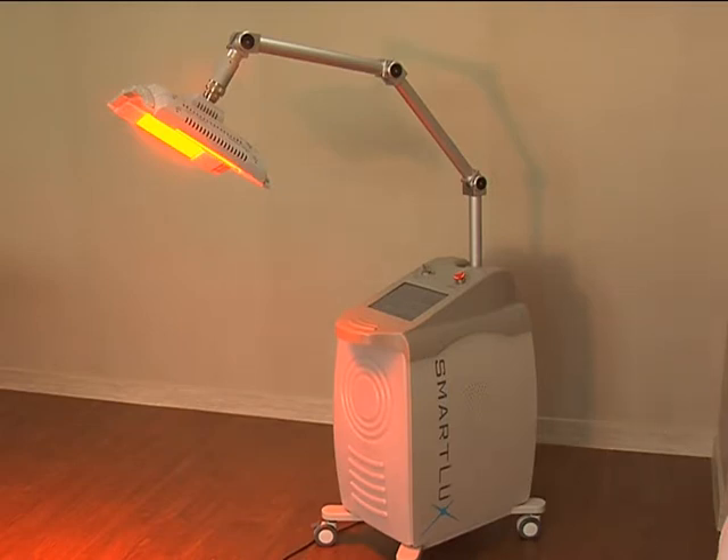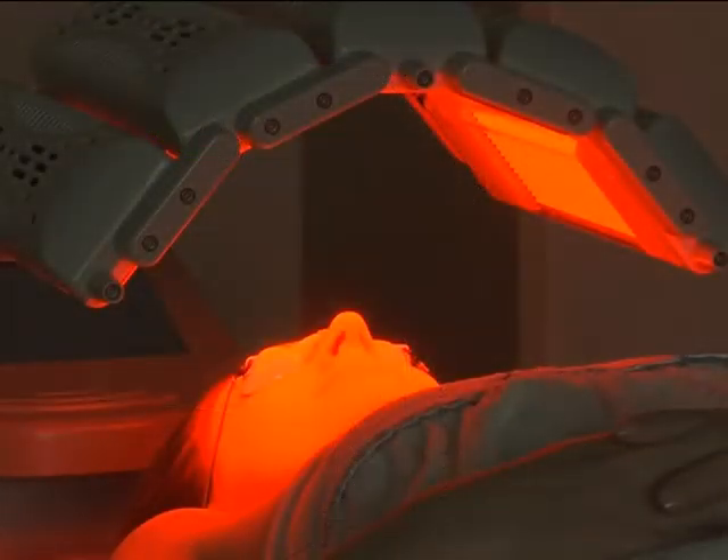SmartLux is a newly developed method in treating skin rejuvenation and wounds. Let us take a look at some of the great features of SmartLux Photo Therapy.